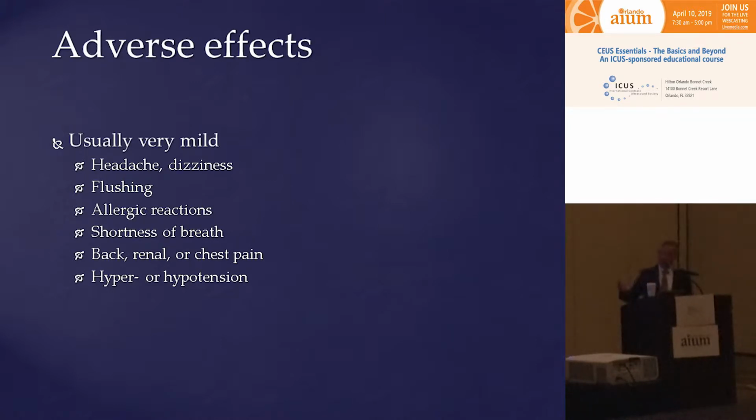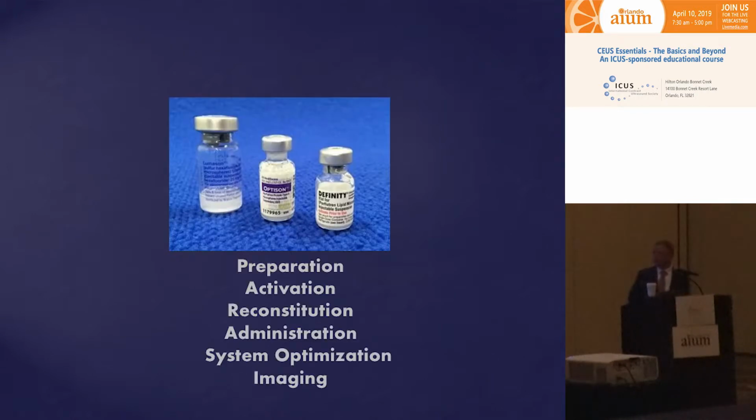So if you see a patient who is complaining of back pain right after contrast injection, know it will go away. Tell them it's usually not severe, just uncomfortable, but if you know that this is very temporary, you can comfort the patient, and all those pains and aches in the back go away. And again, it's extremely uncommon. We had only 2 cases in 15 years of doing this. Okay, so let's go through contrast agents because all of them are slightly different in terms of preparation, and I'll show you the differences between them.